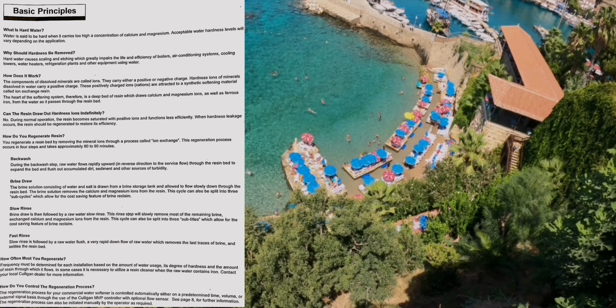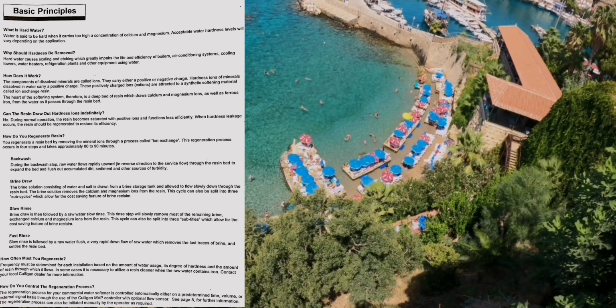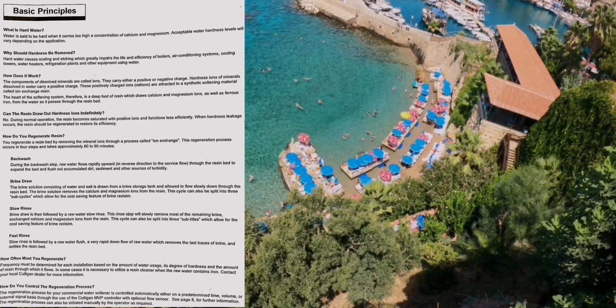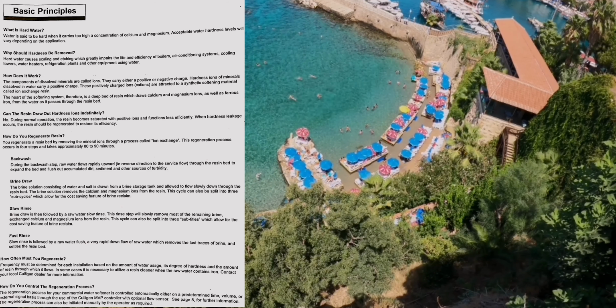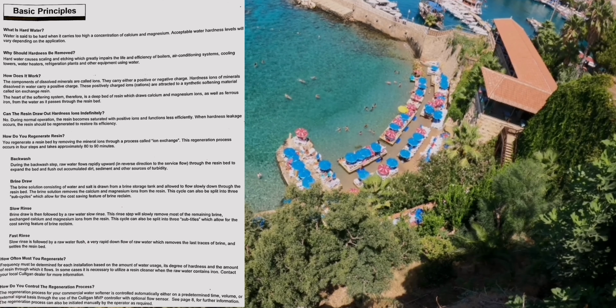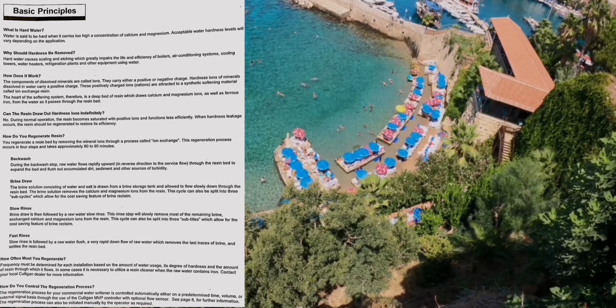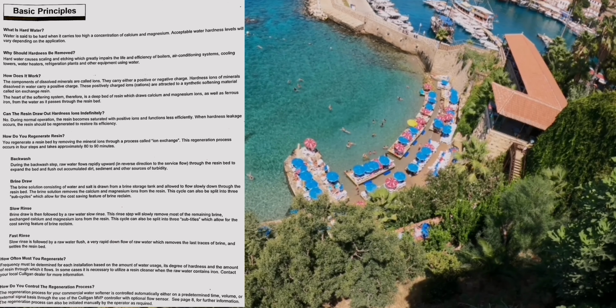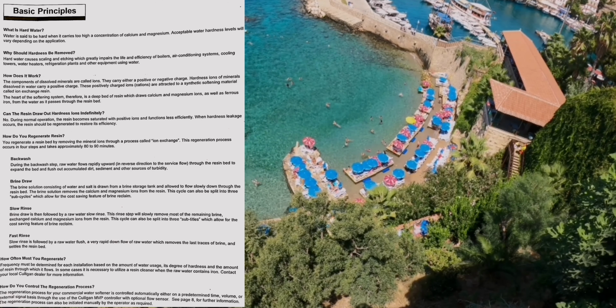What is hard water? Water is said to be hard when it carries too high a concentration of calcium and magnesium. Acceptable water hardness levels will vary depending on the application. Why should hardness be removed? Hard water causes scaling and etching, which greatly impairs the life and efficiency of boilers, air conditioning systems, cooling towers, water heaters, refrigeration plants and other equipment using water.